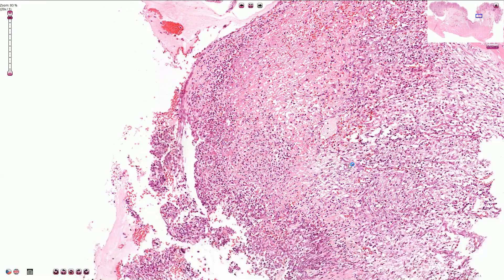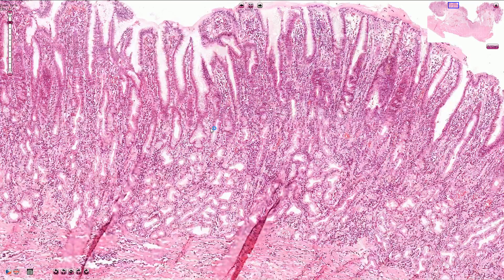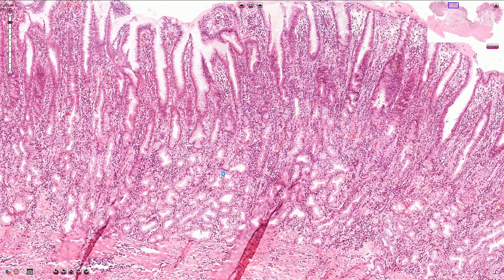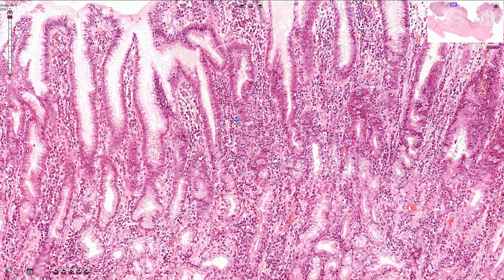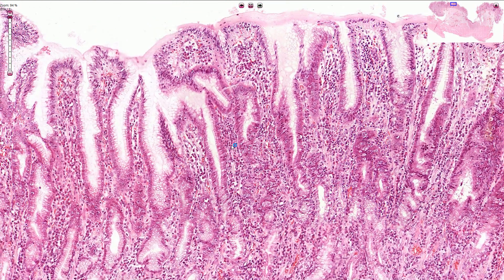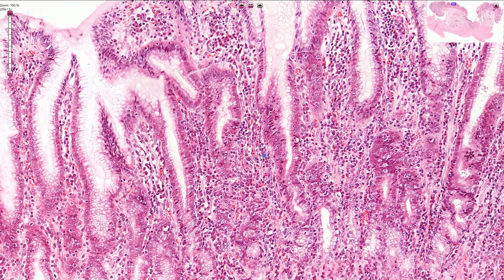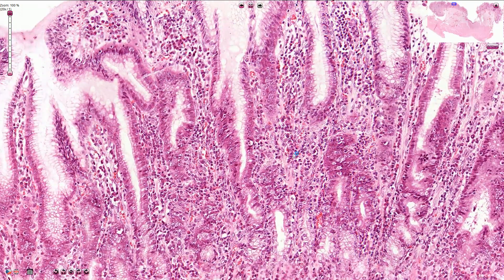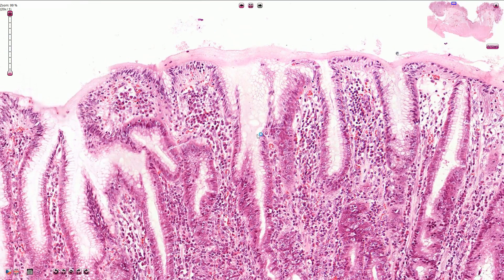Looking at the adjacent mucosa, we can see that we are in the gastric antrum. Here we have the gastric antral glands, and in the lamina propria we can see chronic active inflammation composed of lymphocytes and neutrophils with multilobated nuclei. Very probably the cause of the peptic ulcer in this case is chronic active gastritis associated with H. pylori infection.